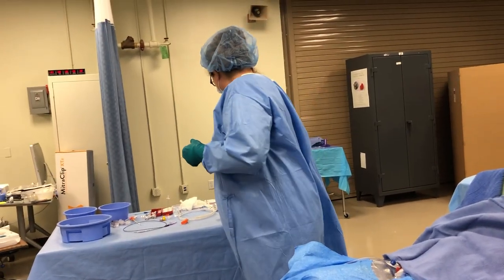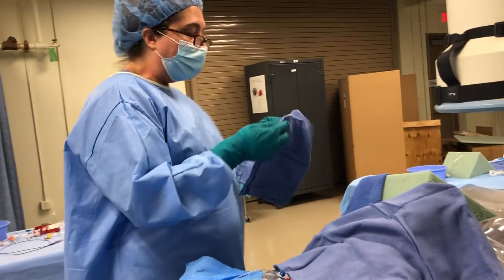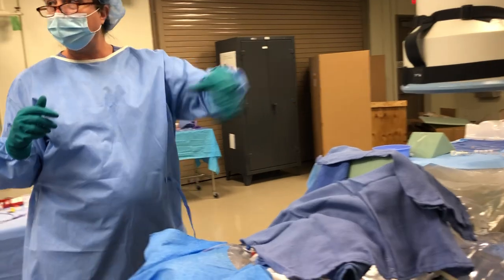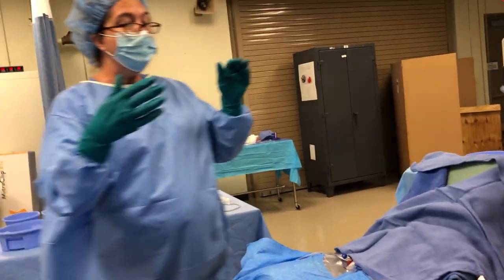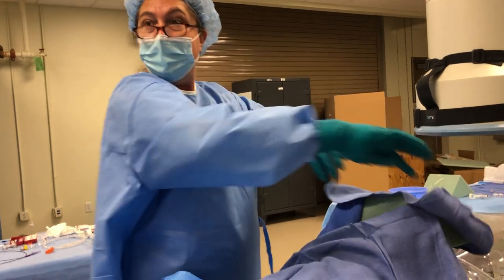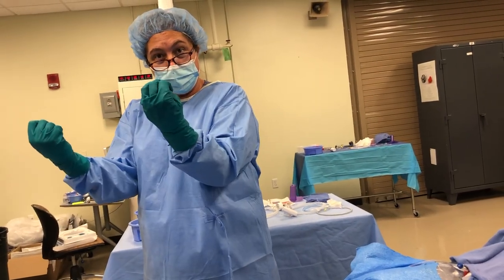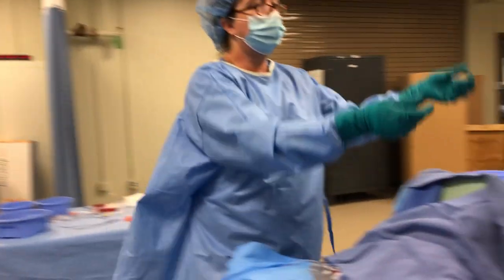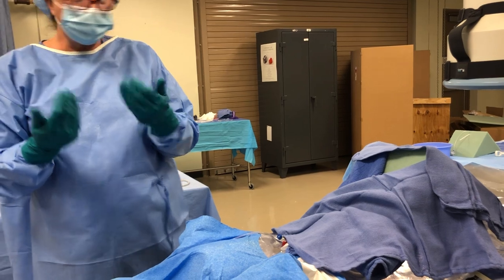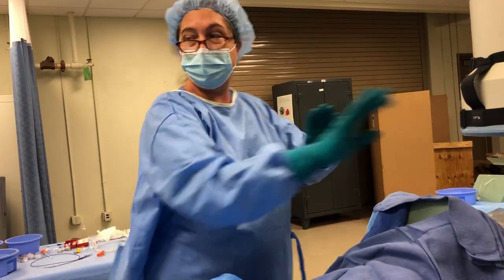Normally I would also put a drape on the top. When you're draping like this, remember to protect your hands — think about when you're gowning your doctor, how you've got to get your hands back. When putting tube drapes on, you've got to have your hands covered. Same thought process. Don't hit the patient on your way laying these down.